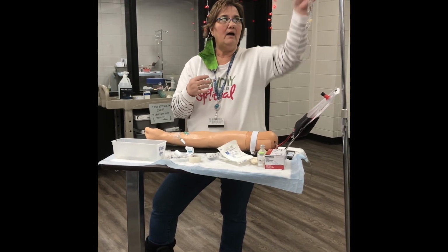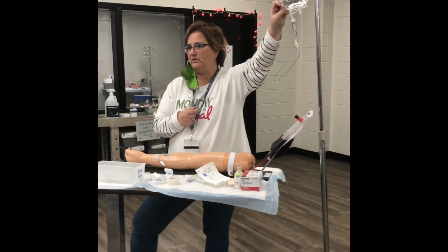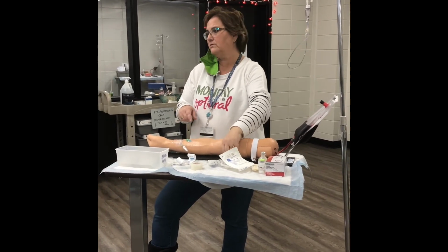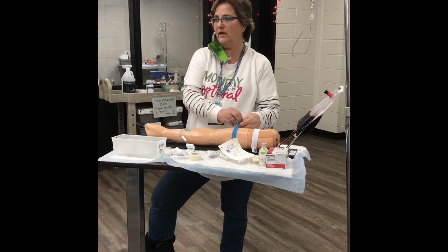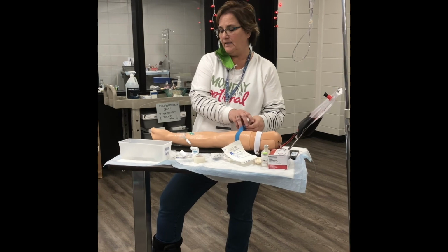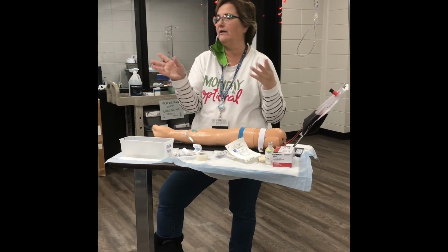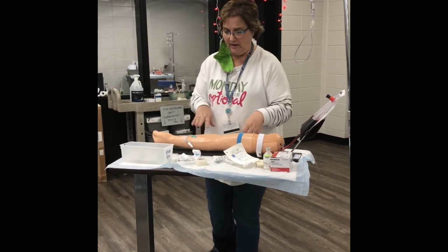Charting that. Normal saline DC'd with approximately 220 milliliters left in the bag. IV site without swelling, coolness, heat, redness to site. Flush with 2 milliliters normal saline with no swelling at site. And of course, how you left the patient and how they tolerated it. I'm not gonna go through all that.